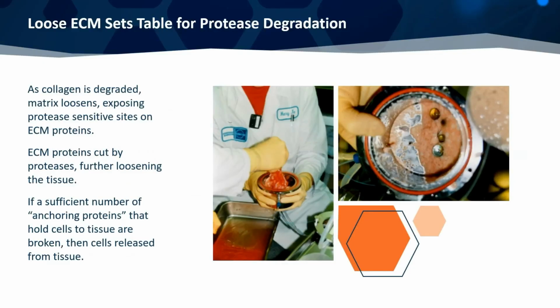And at that time, we were doing complete digestions of the organ and measuring the islet release using an automated image analysis system, where, of course, people who do islets realize use zinc stains to isolate the islets, because the zinc is used to bind together the insulin in the granules.